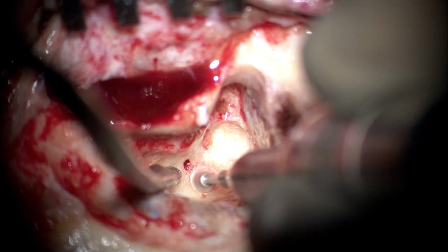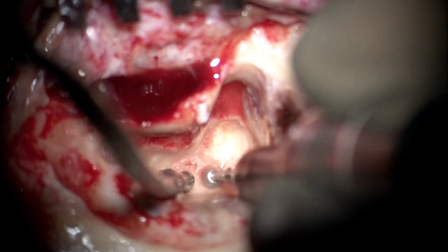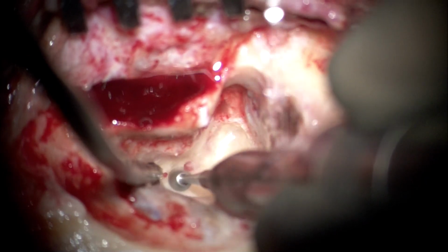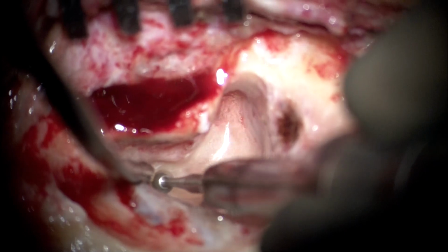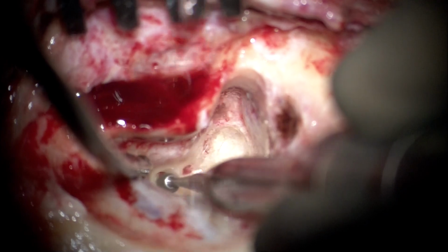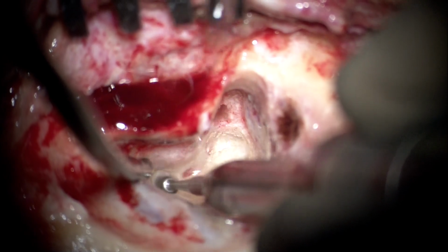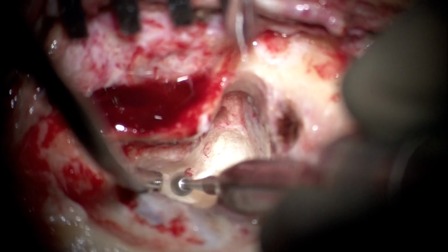We shift to a smaller cutting burr to drill out all the canals and the crus commune, which we had previously exposed. Since we had to further expose the posterior ampulla, we had to reduce the size of our burr, because a larger burr would inadvertently start to cause damage to the vertical facial nerve, which lies lateral to our posterior ampulla.